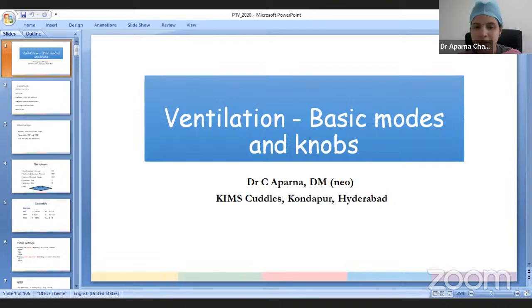Ventilation, which may include inadequate recruitment of the lungs or endotracheal tube factors. There can be associated pulmonary vascular resistance issues or hemoglobin, which can be low, etc. And we should never be using FiO2 of more than 60% without analyzing why this is required.